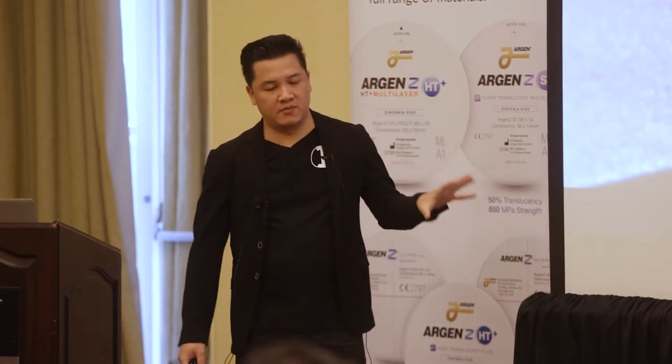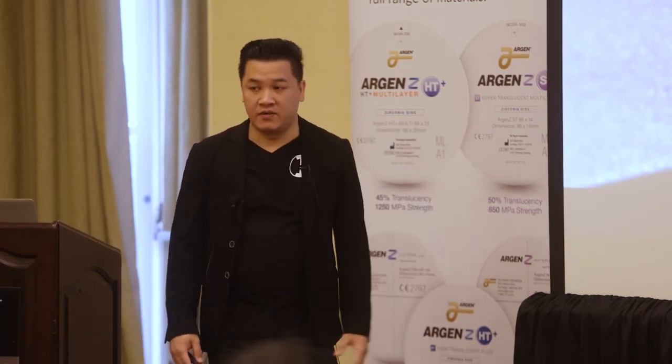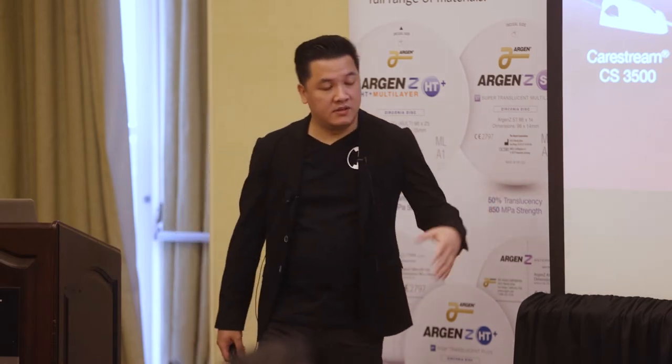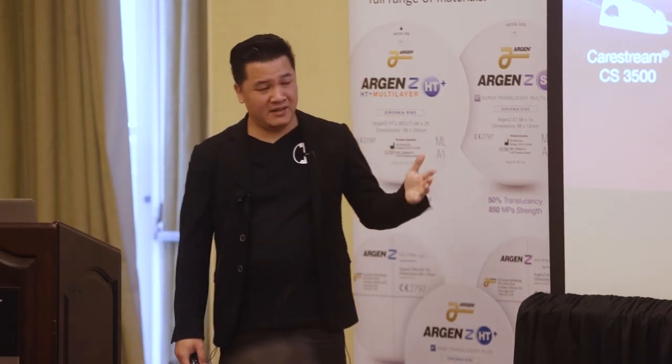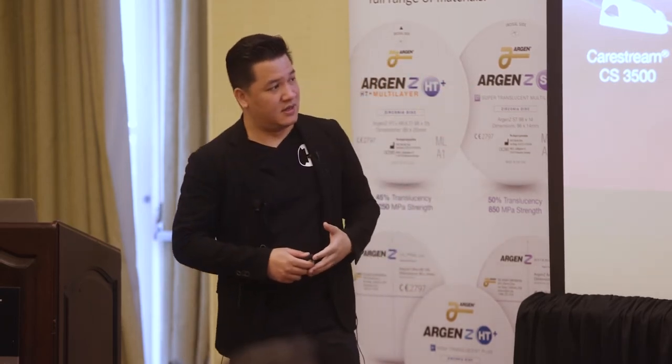So I always feel like we're going to have a desktop scanner in the lab because you still need to scan things in. Maybe you duplicated something. There's always going to be one in the lab, but it might just sit in the corner and be used occasionally, not as much as we had for the last two decades. And really with digital impression scanners, I'm not going to get into too much detail, but when it comes down to it, the more expensive one is probably better than the cheaper one. So make sure you communicate to your clients which ones you're able to work with, right? That you think are best.